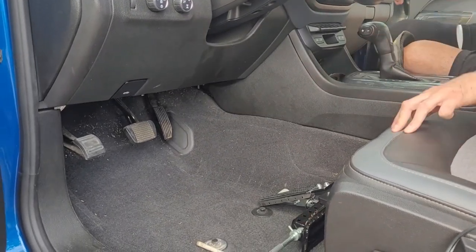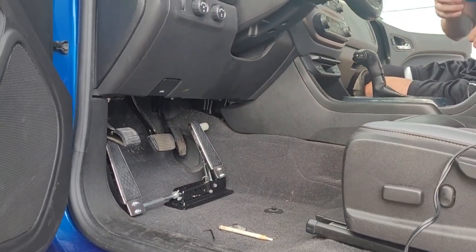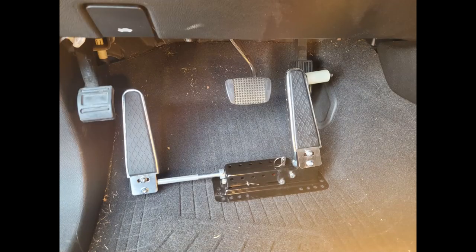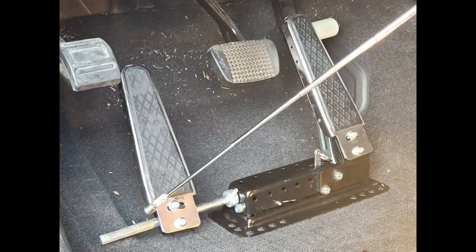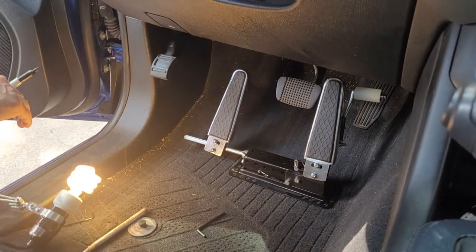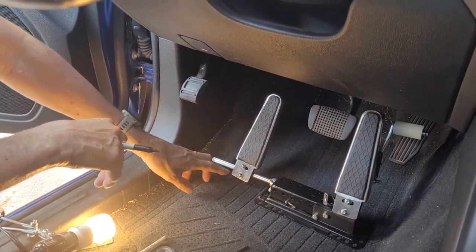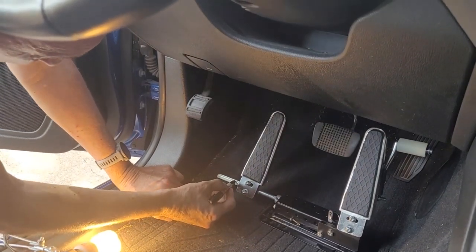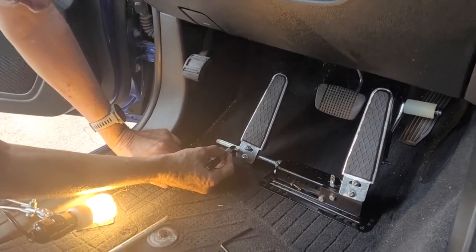We're going to take the assembly back into the interior of the truck to look for the final position of the assembly in relation to the factory gas pedal and the factory brake pedal. We've got to drill two holes in the floorboard to screw the base plate to the floorboard, so we have to determine the final location of the pedal assembly. This rod is hitting the floorboard on the left side — this truck is a mid-sized truck, not a full-sized truck, so this pedal assembly is a little too wide.